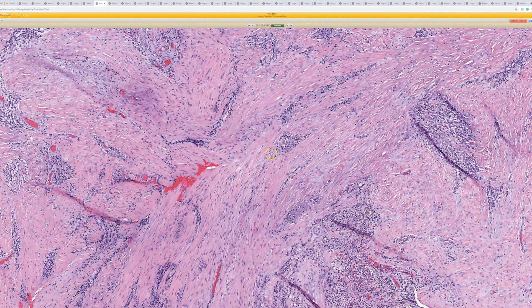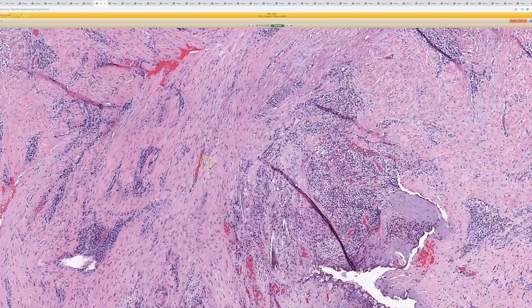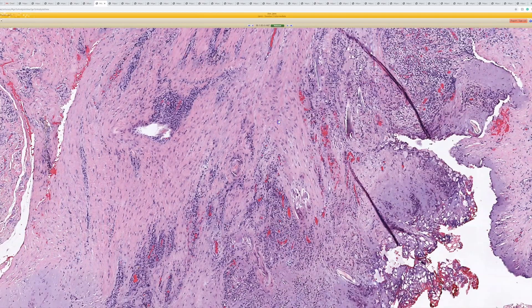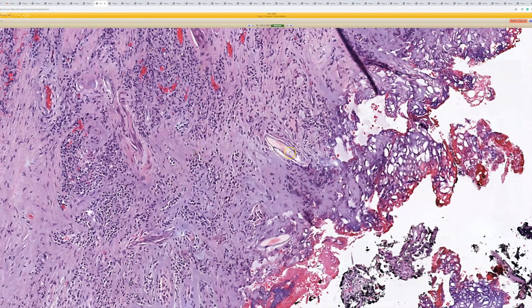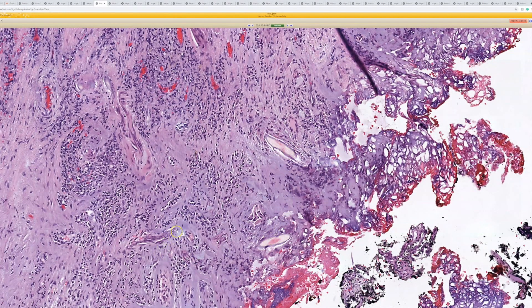That's basically converted into scar. This is scar tissue — it's got parallel fibroblasts and prominent vessels. And then even deeper down, you begin to see some naked hair shafts. There's a hair shaft, there's a hair shaft. So this is a pilonidal cyst or pilonidal sinus or pilonidal sinus tract — whatever name you like. I often use pilonidal cyst slash sinus in my report when I sign them out.